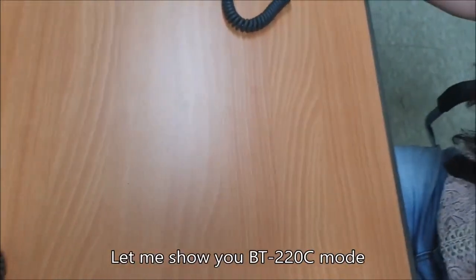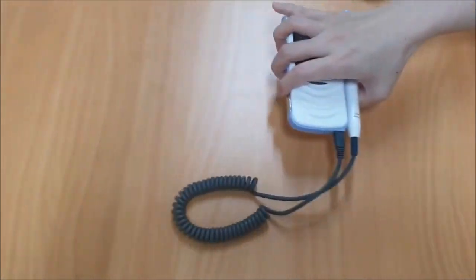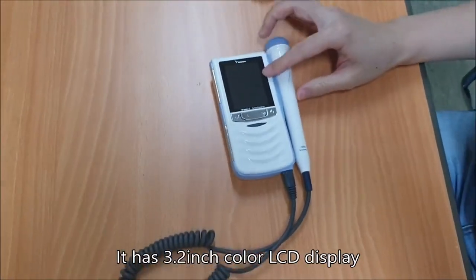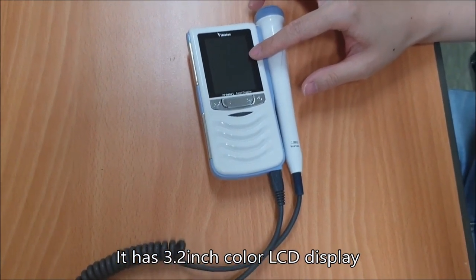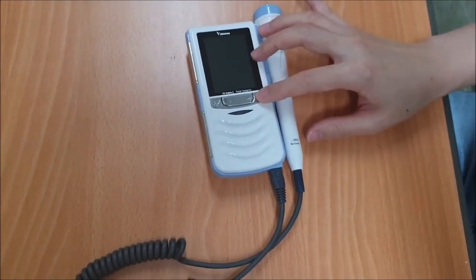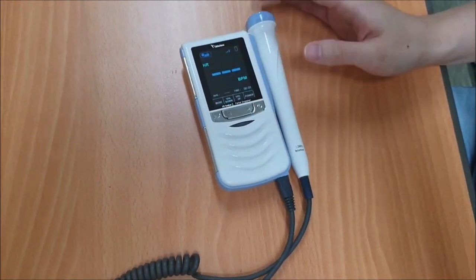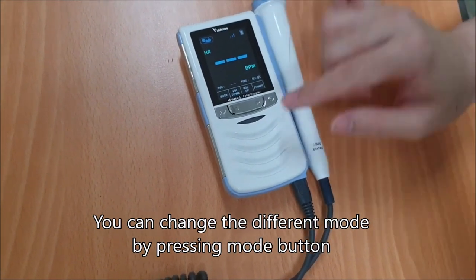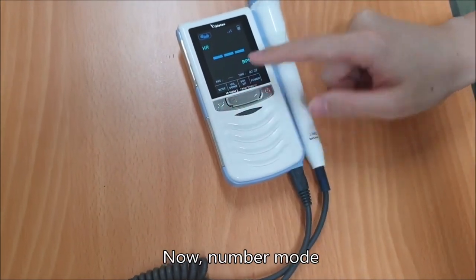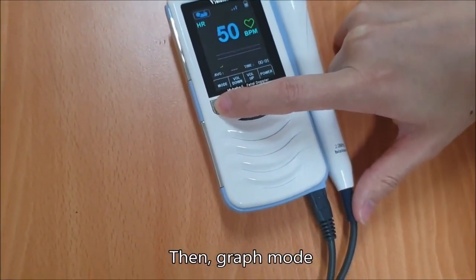Let me show you the BT-220C model. It has a 3.2 inch color LCD display. You can change to a different mode by pressing the mode button. Now, number mode, then graph mode.